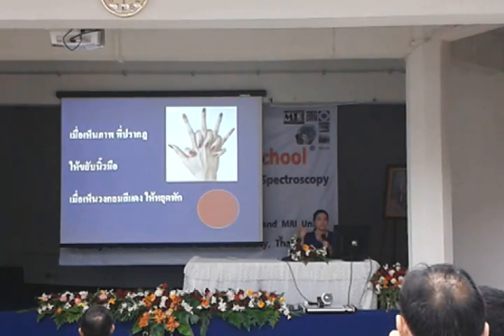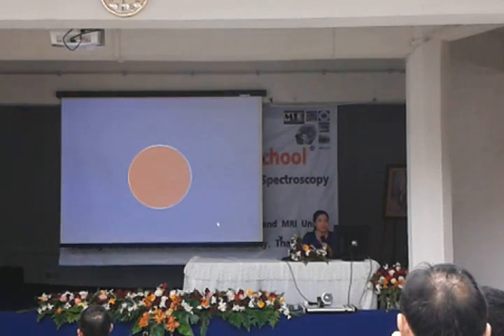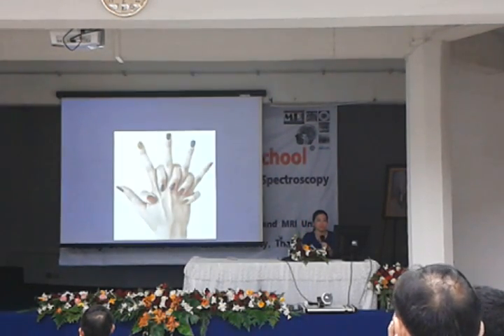For example, at the Siriraj Hospital, we have a program that shows the patient a screen. When the patient sees the multicolor finger nail, they have to move their finger. And if they see the red button, we have to stop doing finger tapping, something like that.